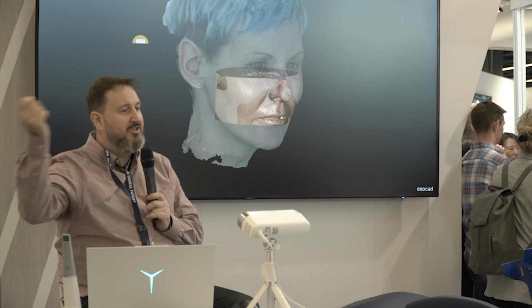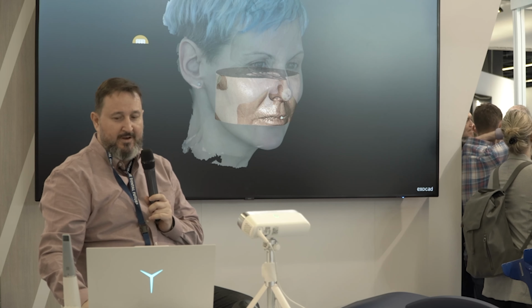Different positions. As I had the CBCT, I can perform, just changing the units, different images. In this case, the same CBCT for the jaw, it changed to look at the volume. Now you can see the volume, and the volume fits perfectly. The same with the lower jaw.